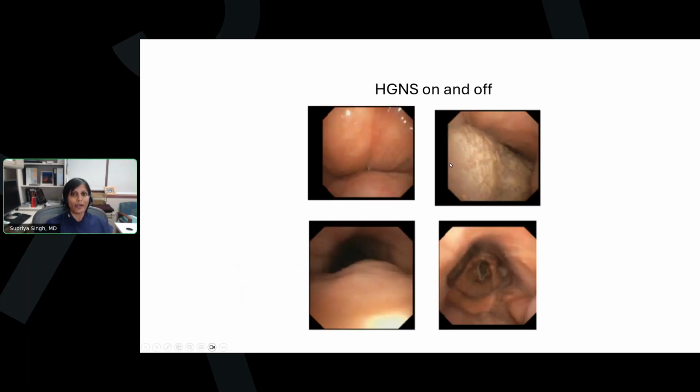This is a case where the patient had a hypoglossal nerve stimulator. And in this picture, this is an AP collapse of the soft palate, and then the base of tongue is completely collapsing with no view of the vocal cords. Once the therapy was turned on, as you can see, the airway has opened up nicely, posterior pharyngeal wall, soft palate. And then this is the oropharyngeal area where you can see that the base of the tongue is no longer obstructing the laryngeal inlet.